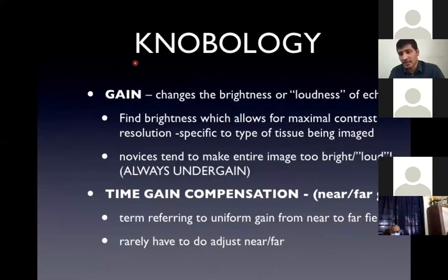Gain is the brightness of the image. If we increase the brightness, that doesn't mean the image looks nice. If you try to keep the gain low, the image looks nice, because more gain adds more disturbance. It makes your image bright, but it's not good.